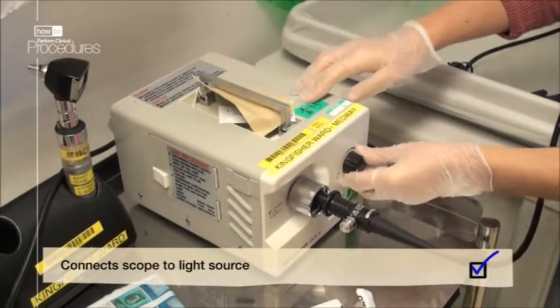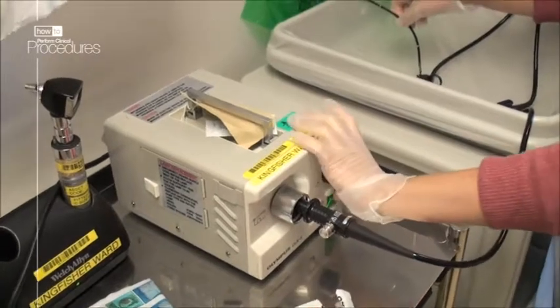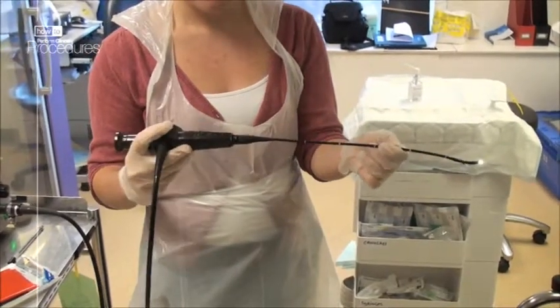First, plug the scope into the light source and adjust the brightness as necessary. Light is transmitted from the source through the flexible fiber optic cable. The eyepiece on the scope is where you look through.